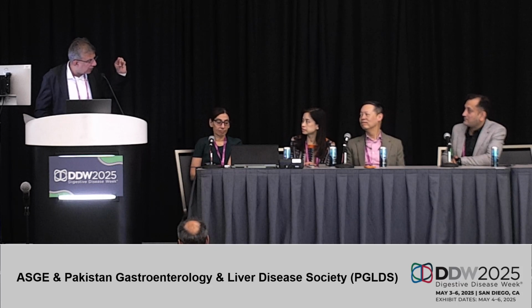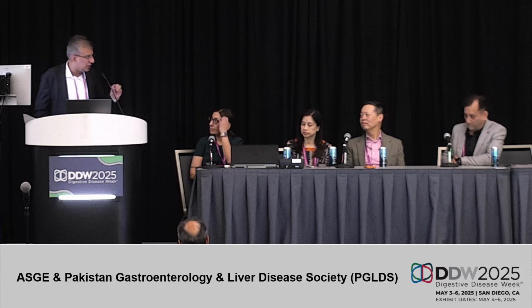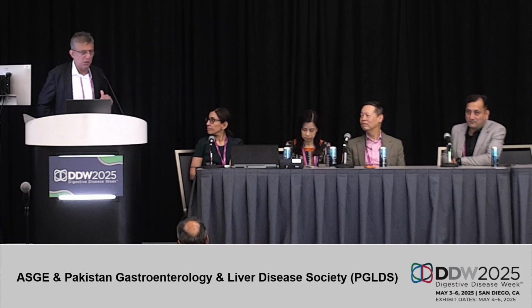They can be 3.5 centimeters in size. CT is picking up only a large 3.5 centimeter node, but a sub-centimeter rounded node which cannot be picked up by the best of CT will be picked up by us, by EUS. So I am very clear, you are adding on to all imaging.